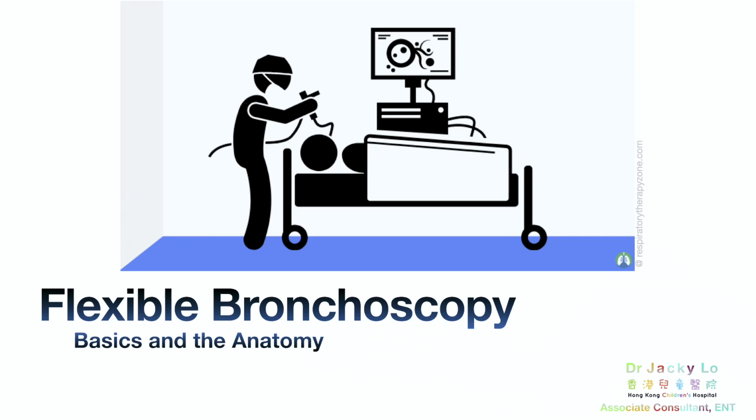I'm a pediatric otorhinolaryngologist from Children's Hospital. In this video, I'm going to talk about some of the basics of flexible bronchoscopy and also the anatomy that we would encounter during a flexible bronchoscopy.